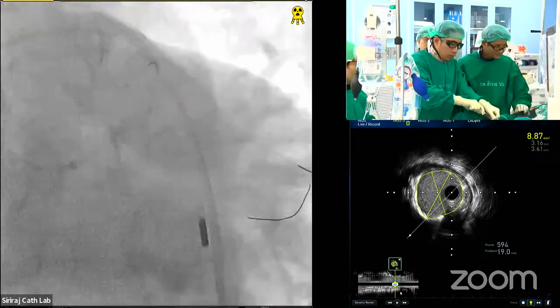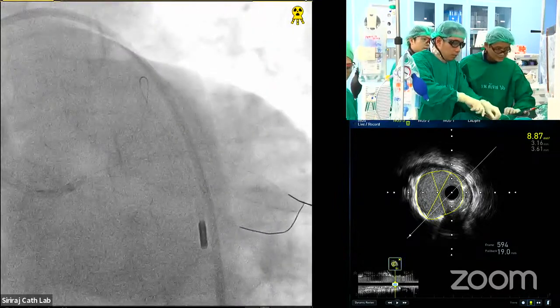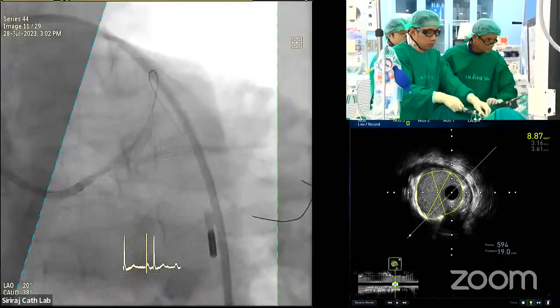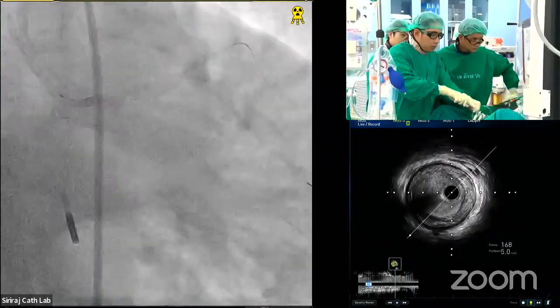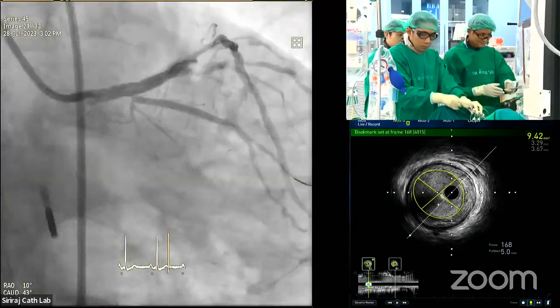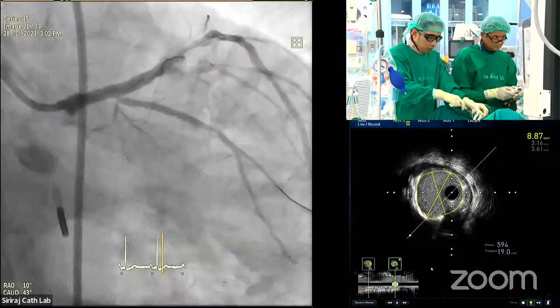I mean, I guess in the provisional approach, often there could be carina or plaque shift and you get a seemingly angiographically tight ostium but with TIMI 3 flow. Well, what is the guidance here? Do you then need to kiss this and not just finish with a POT, Goran? Yeah, to be honest, in this specific case, I'm not sure that I would recommend routine kissing.